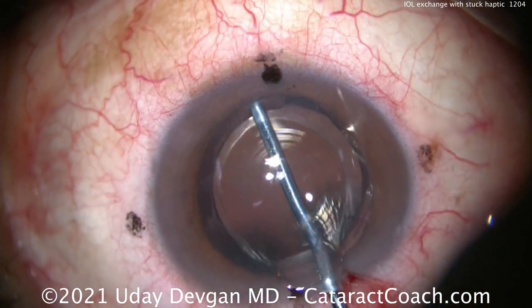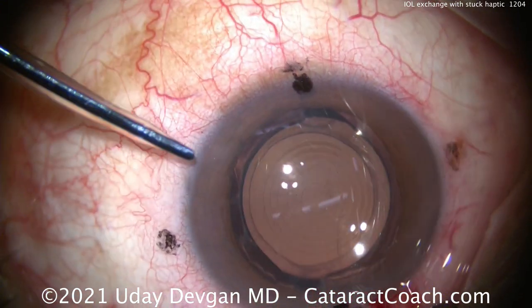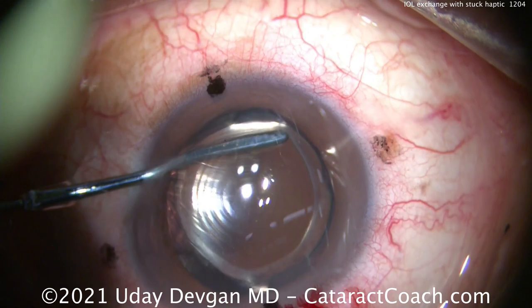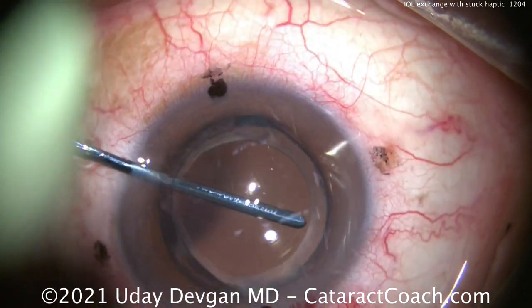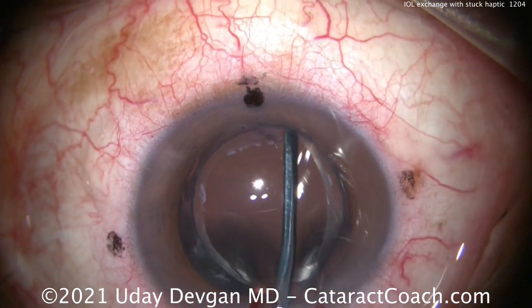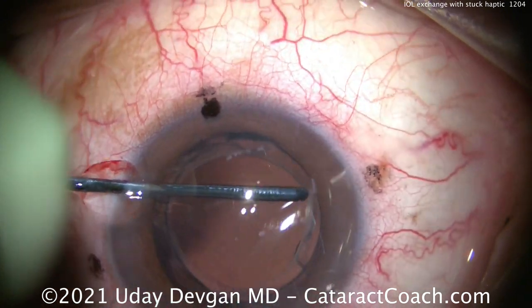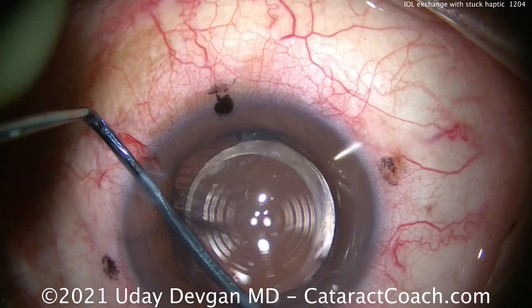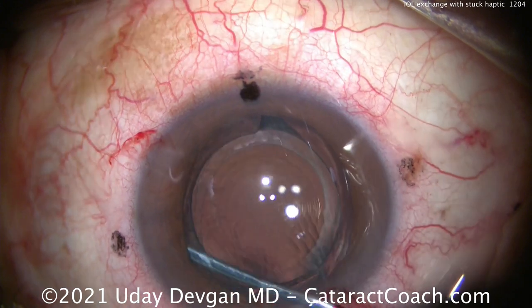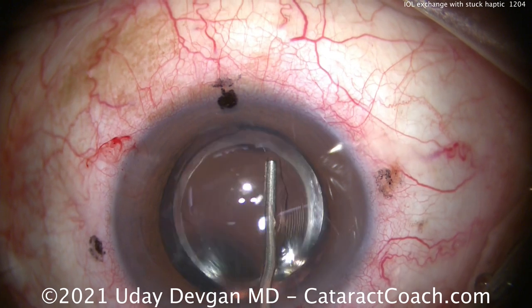Now we can get that spatula — this is a blunt cyclodialysis spatula. I'm pivoting as much as I can to get 180 degrees of freed-up capsule. Going over to the other side, it's still tough to get under there, so we may need to inject more viscoelastic. Trying to get under there — not quite going to happen, so try this method. There's a gap. The key in the whole case is you have to really separate the anterior capsular leaflet from the posterior capsule where they fuse together. You can see that whitish haze there on the edge of the capsule — it's already starting to fibrose, which is the normal healing response.